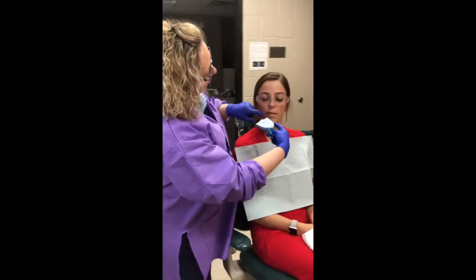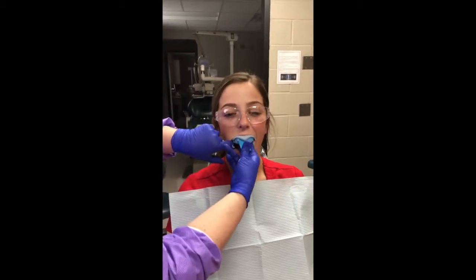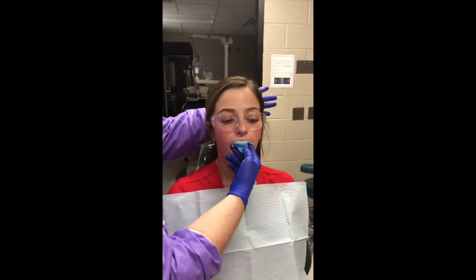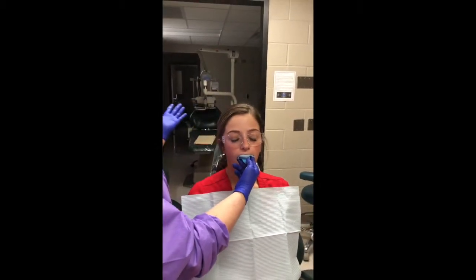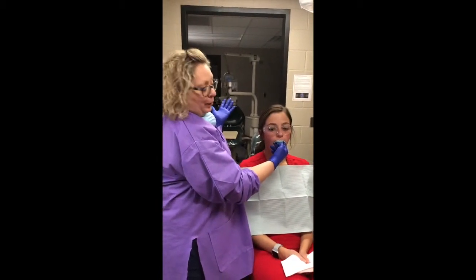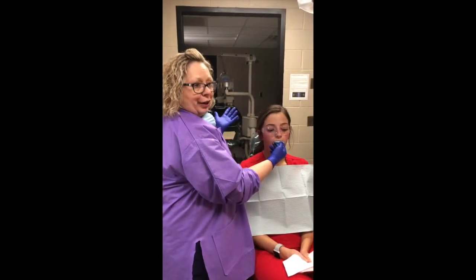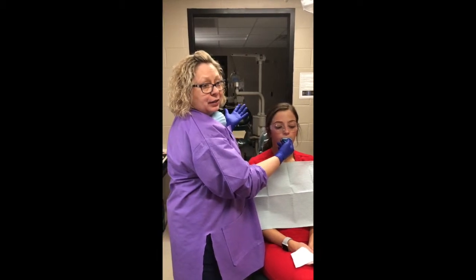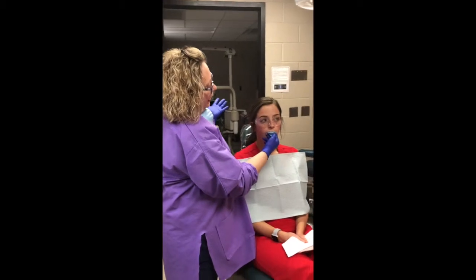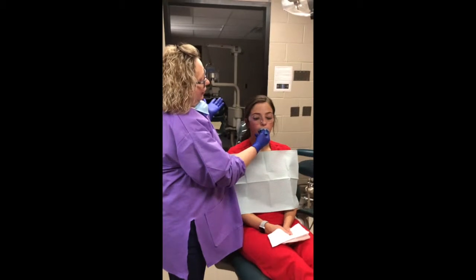Okay, so I'm going to ask you to open. Okay, so now I'm going to seat it at the molars first, and then I'm going to push it up to seat it in the front. And I'm just going to hold it. If our water was the correct temperature, this should only take about a minute or so to set up. The room that we are in is kind of warm, so that can affect the setting time as well. Sometimes taking it longer or making it set up a whole lot faster than we intended.